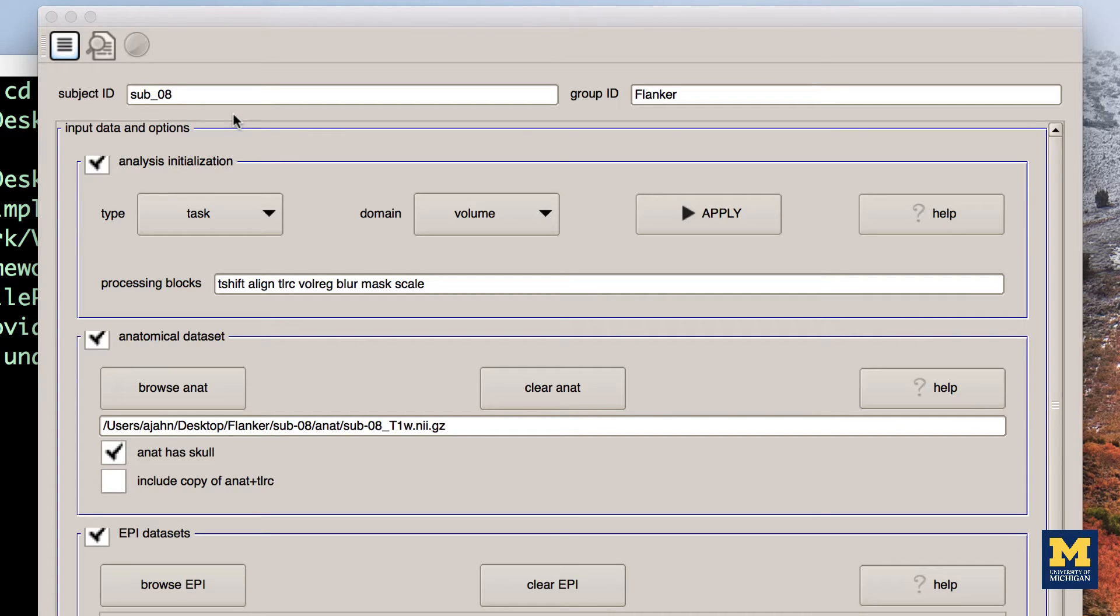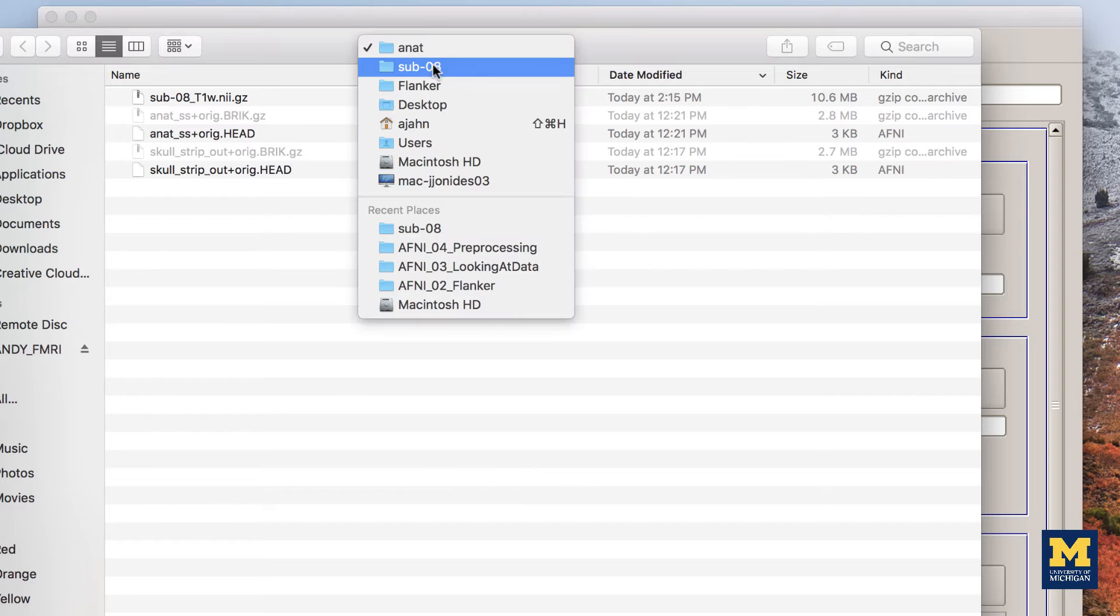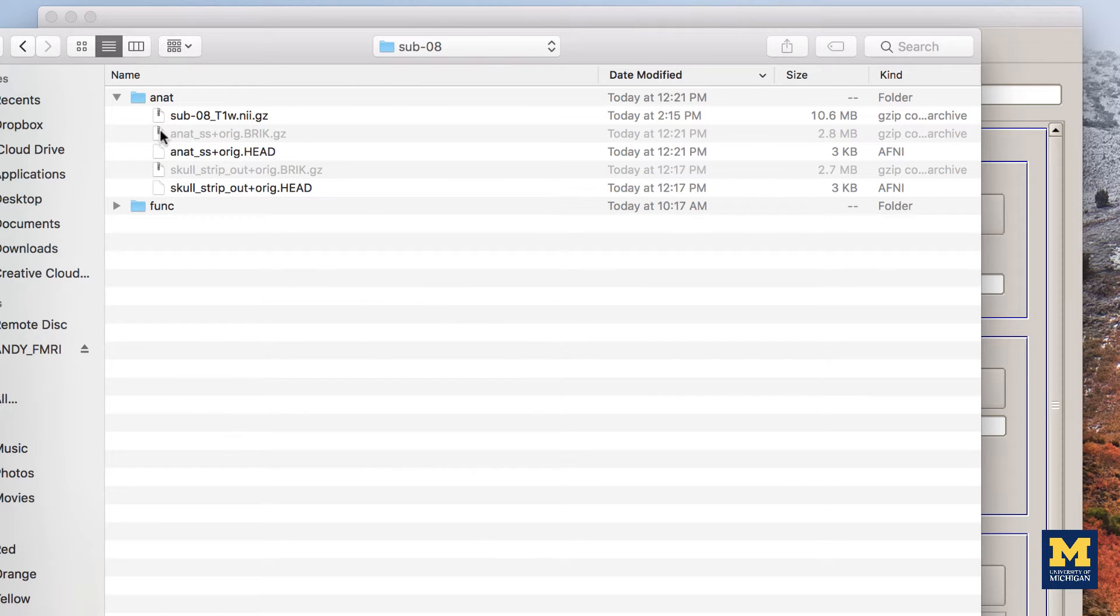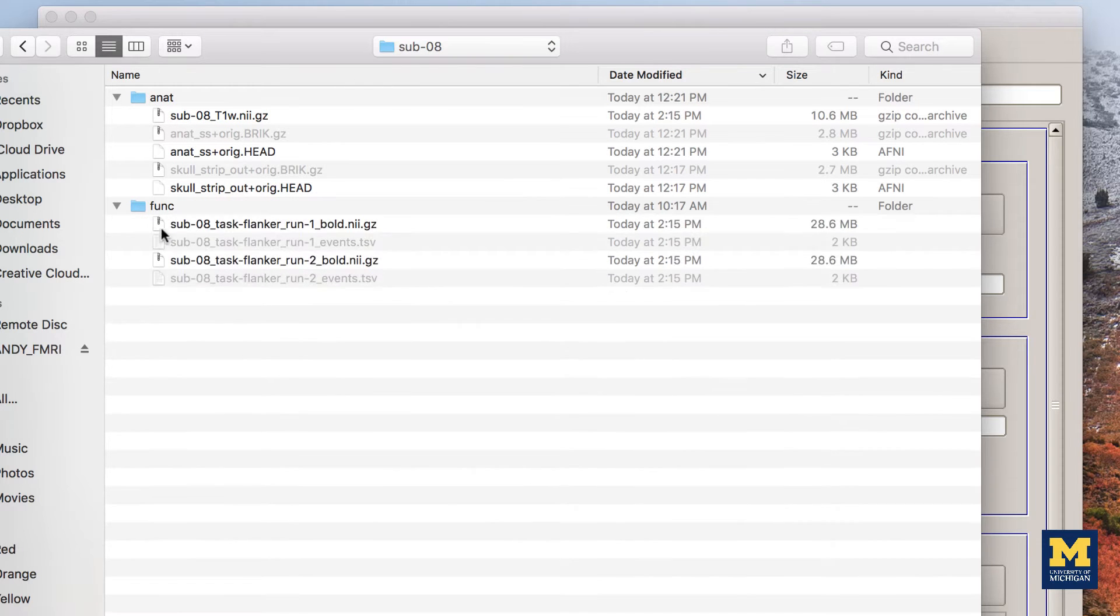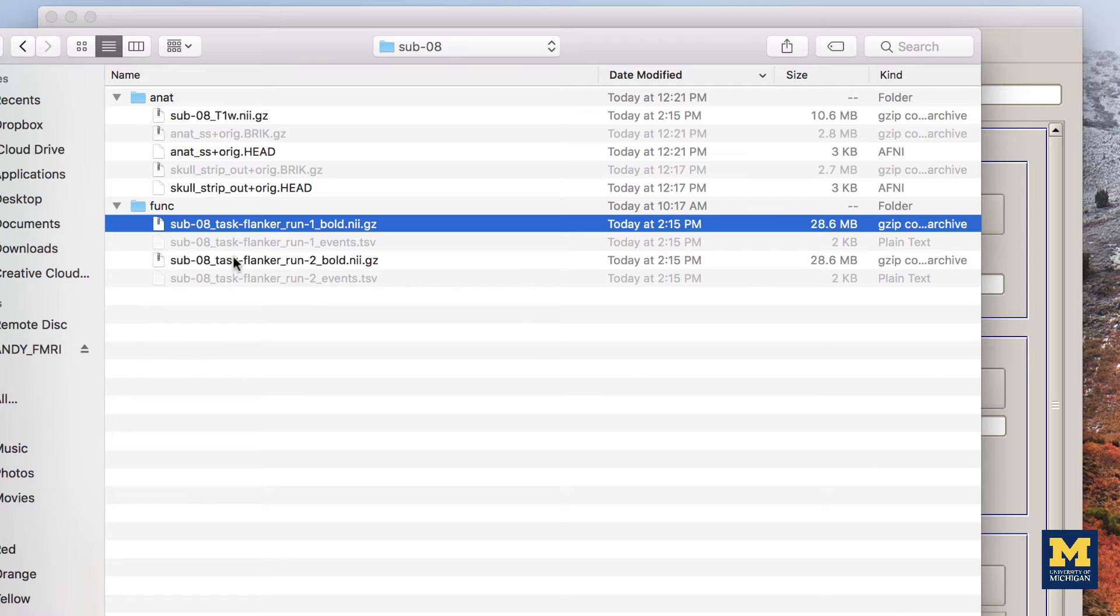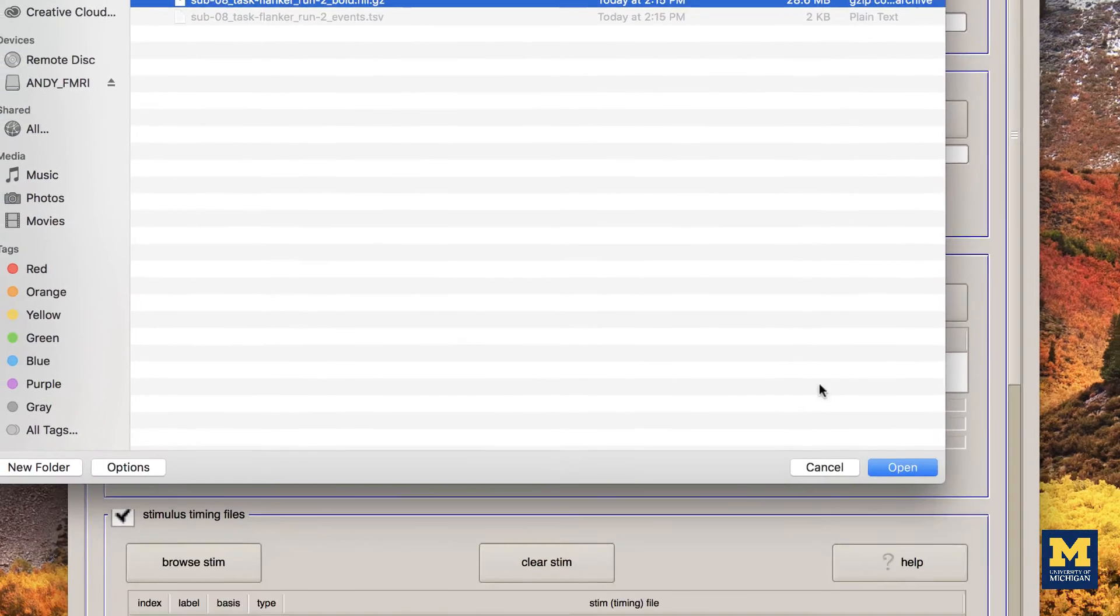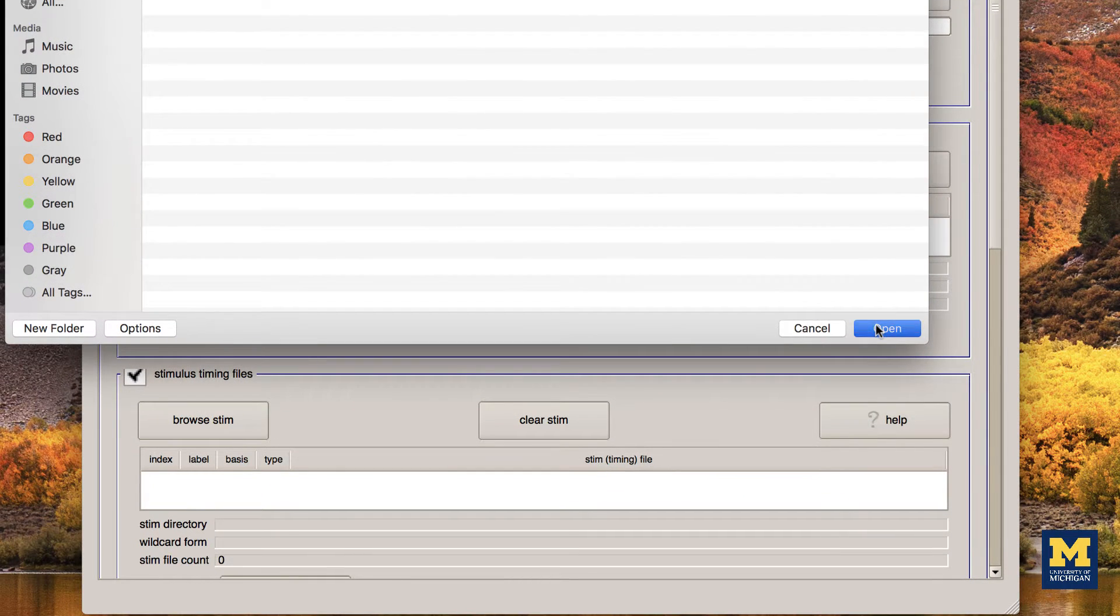Select the Functional Datasets by clicking the Browse EPI button in the EPI Datasets section. Navigate to the Func directory, and then hold down Shift and click to select the files sub-08-run1 and sub-08-run2.